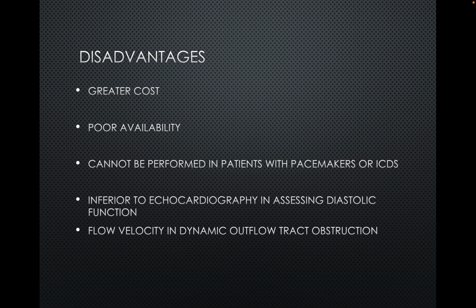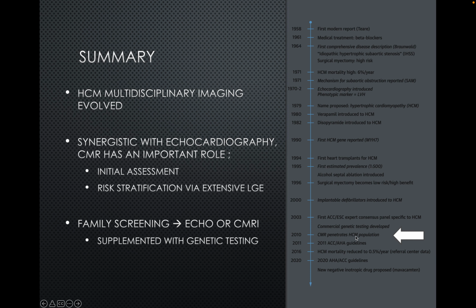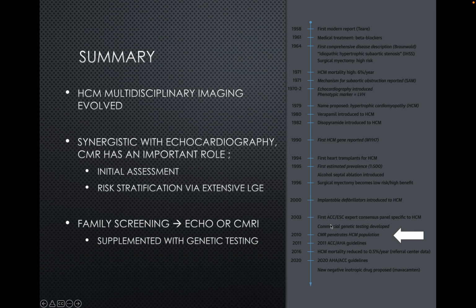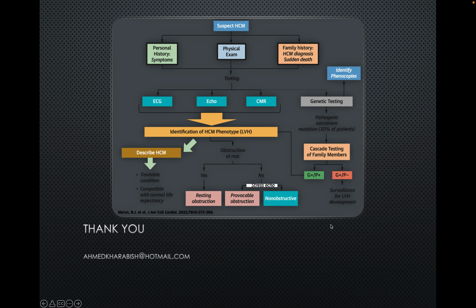Of course, without any bias, MRI has some disadvantages like any other modality. MRI has been in the guidelines since 2010 in the management of HCM. And thank you.